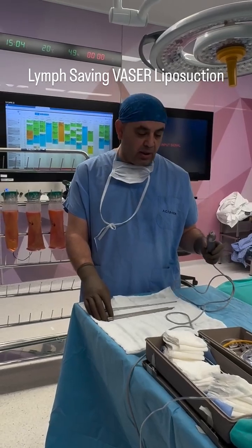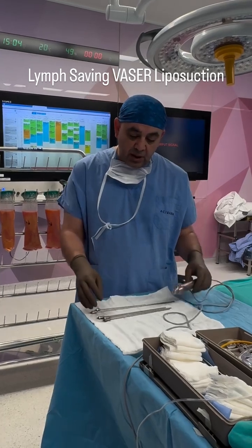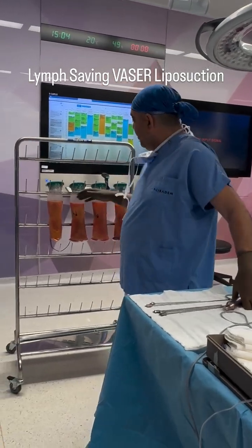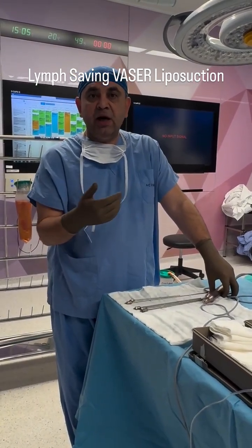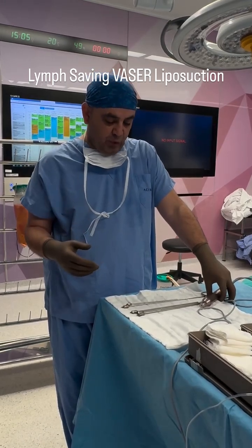Hello, today I'm operating on a stage 3 lipedema patient. I completed the back of the patient in the front position. I removed about 6 liters for now. And now the staff will turn the patient and I will continue with the front side for VASER liposuction.